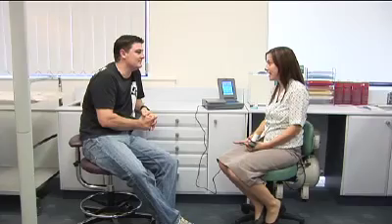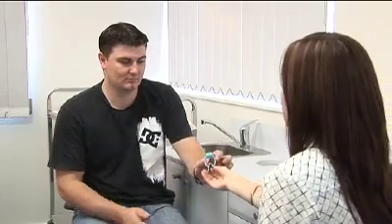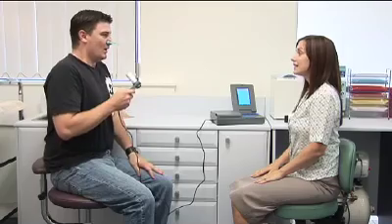It's important when performing the manoeuvre that the patient sit upright in the chair with the feet firmly on the ground, and avoid attempts by the patient to lean forward during the manoeuvre. There should be a nose clip, and the mouthpiece should be firmly sealed in the mouth between the teeth with the lips tightly around it. Provide as much encouragement as you can during the forced expiratory manoeuvre.